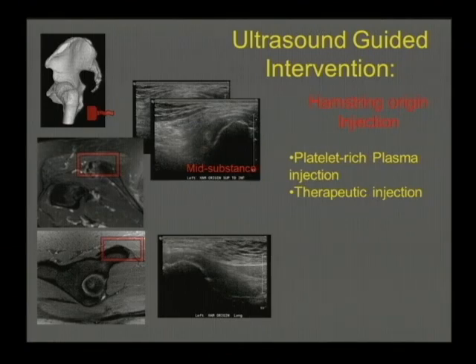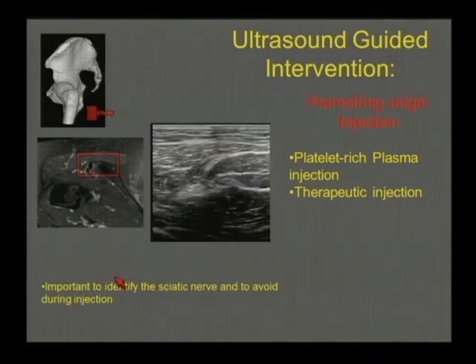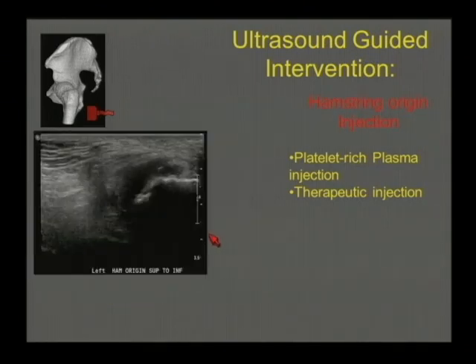Again, we're there with the patient, you can talk with them, and as I press with the transducer, I verify that this is indeed where the patient's symptoms are coming from. This is a corresponding sagittal image showing the origin in longitudinal plane as well. So before we did any injection, we certainly wanted to find out where the sciatic nerve was so that we could avoid that structure. So turning the transducer transverse to the patient, scanning down a little bit, identified that structure kind of superiorly and inferiorly, and made sure that we are away from that before we proceed with the injection.